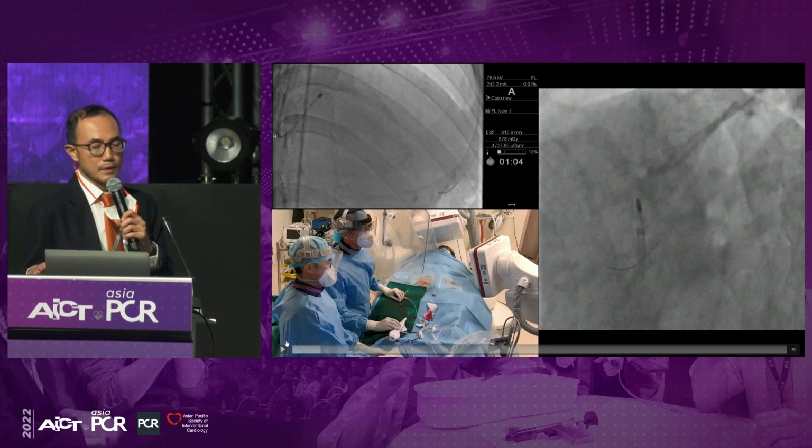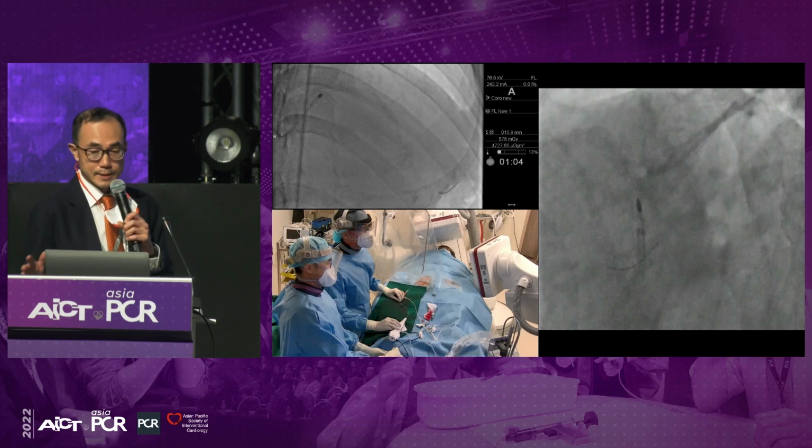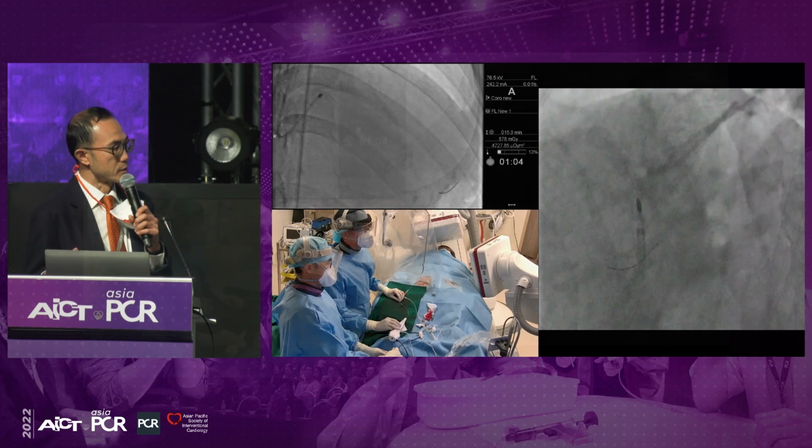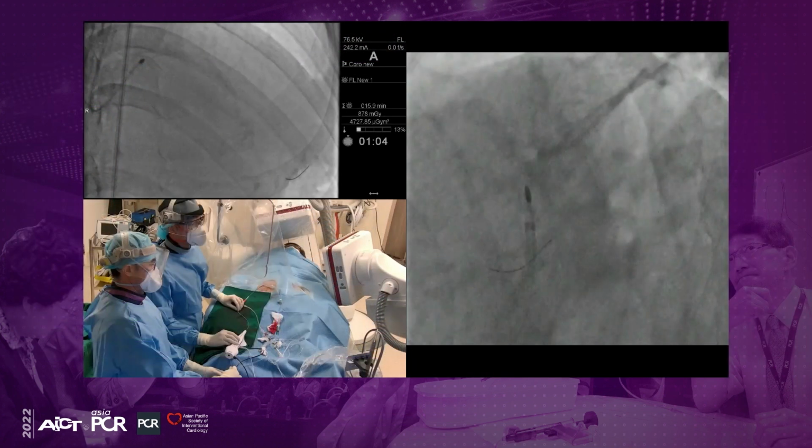You can see from this still panel that we decided that we're going to use rotablation upfront. Clearly, the very extensive calcification will require some form of plaque modification. And we decided that upfront, we're going to have to prepare the lesion so that we can use subsequent devices and also intravascular imaging. We didn't think that we could advance any intravascular imaging device through that tight stenosis.